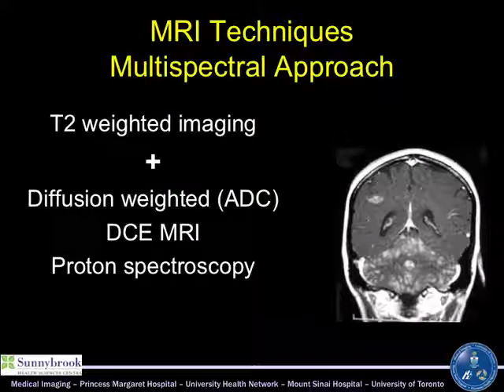So what's changed? MR has been around since the 80s, in Vancouver, and in Toronto maybe just since the last few years. We're always running behind in Canada. But we've certainly had T2 weighted imaging for decades now, and there's been lots of work published on this with MR. There was then a lot of work published on proton spectroscopy, which is another MR technique. I will tell you that these never made it into the multi-center environment, never folded into clinical care.